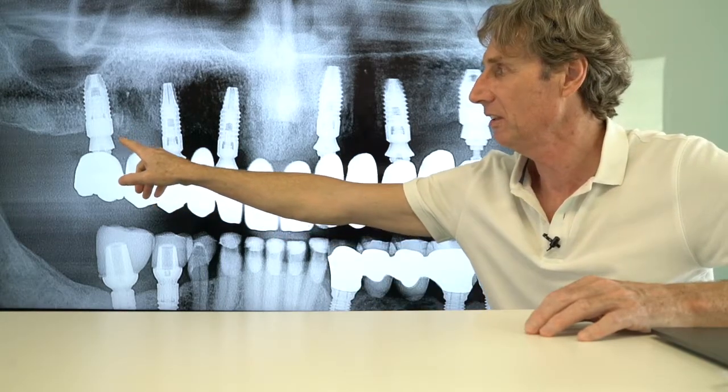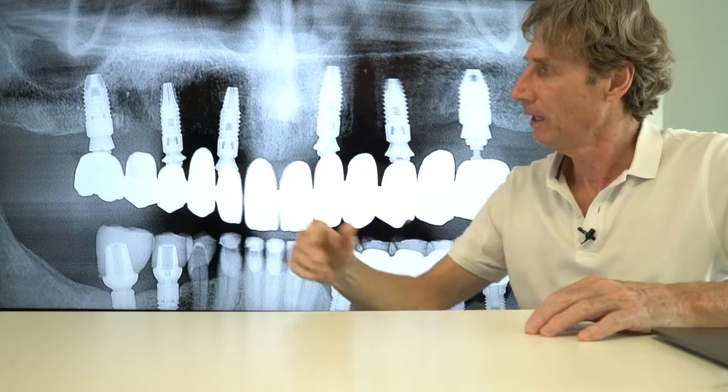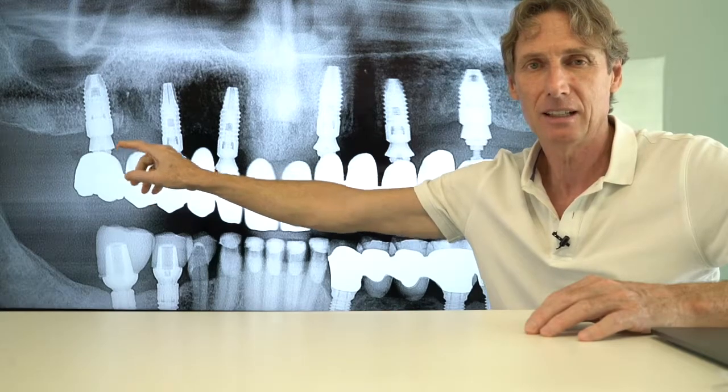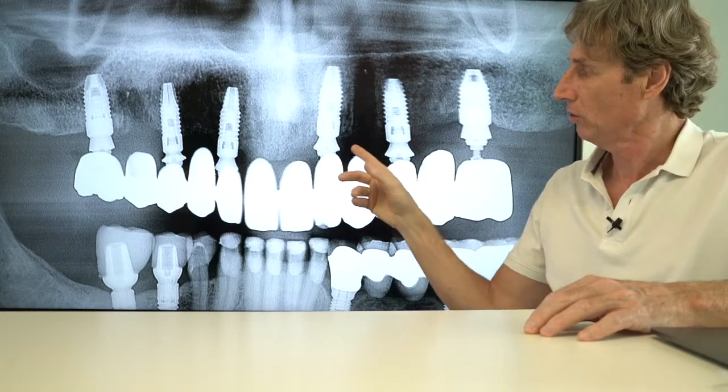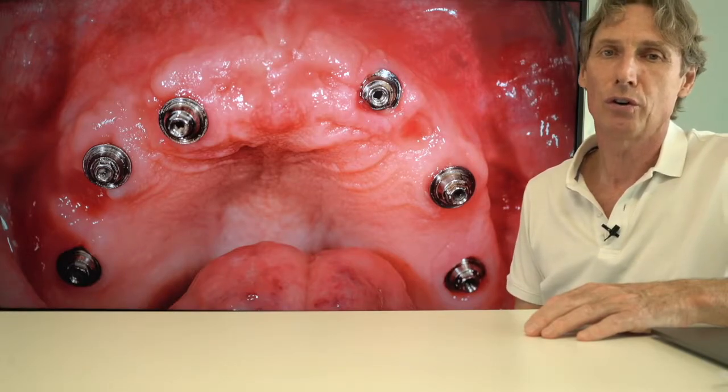What you also can see here is the implant, whatever implant you want to use, it's possible, and then you screw in this worldwide standard of universal multi-unit abutments, and you have several heights to compensate different soft tissue thickness, and you have straight multi-unit abutments and angled ones with 17 and 30 degree, also as standard. So here you see a 17 degree multi-unit abutment, and that produces this combination between the implant and the multi-unit abutment is our baseline for the SIEWERT bridge.